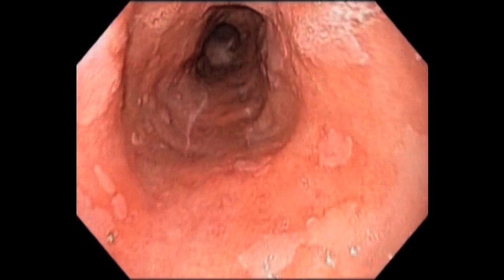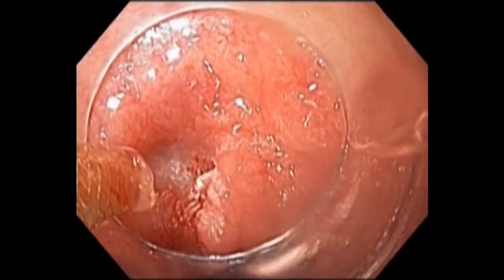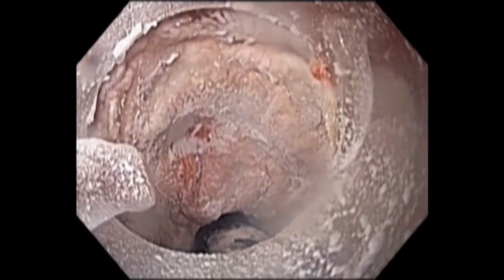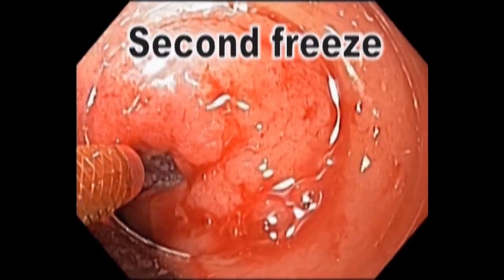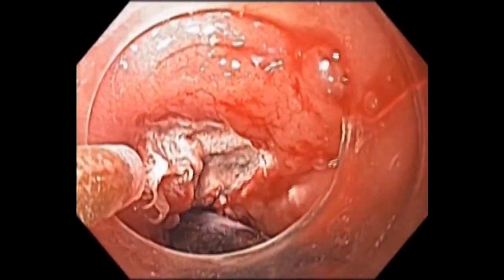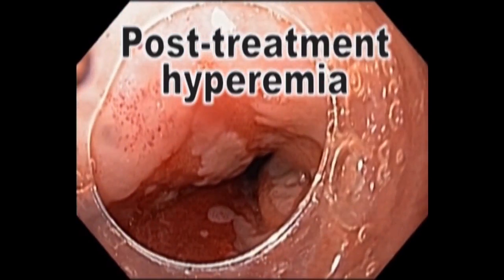This is a patient with long-segment Barrett's esophagus with high-grade dysplasia. The spray catheter is seen extending from the end of the scope. We can see the tissue freezing as liquid nitrogen is sprayed on it. The tissue is frozen for 20 seconds and then is allowed to thaw. After thawing, freezing is repeated for another 20 seconds. This process is repeated until all tissue is treated. The tissue appears hyperemic after successful cryotherapy.